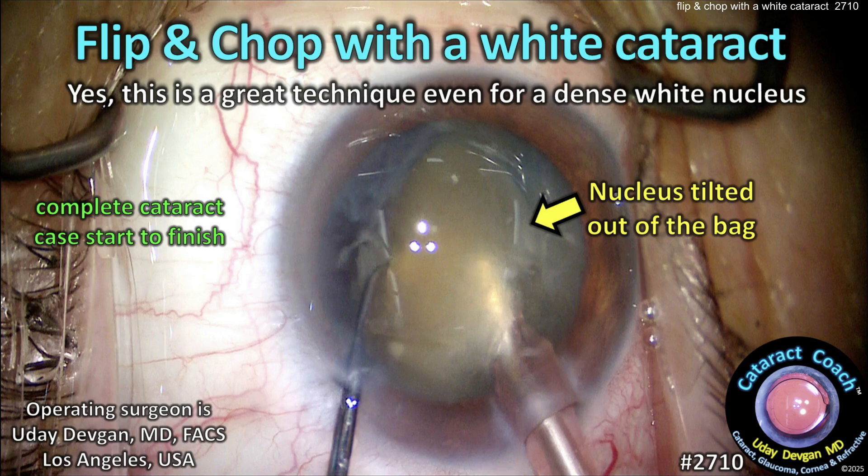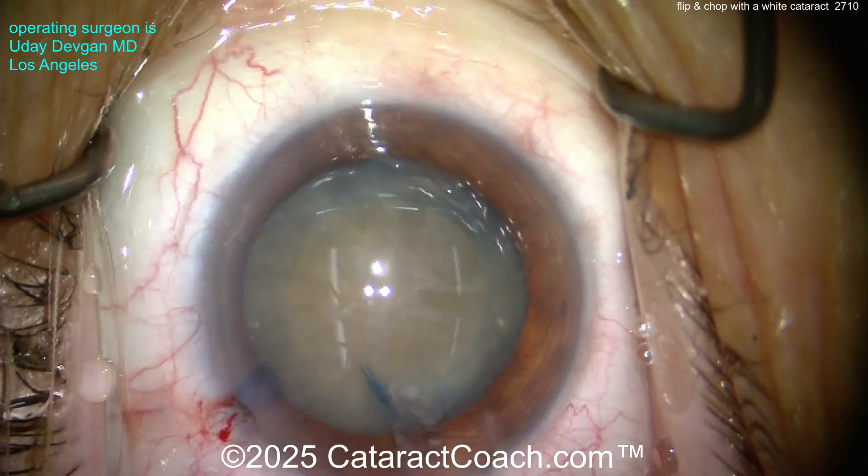CataractCoach.com: flip and chop with a white cataract. Yes, this is a great technique even for a dense white nucleus — well, for an experienced surgeon. This is not for newbies. Let me show you.